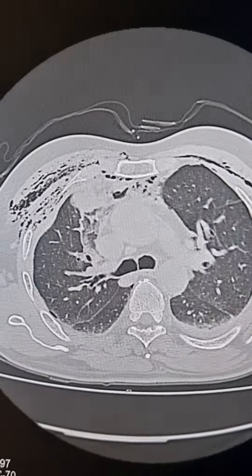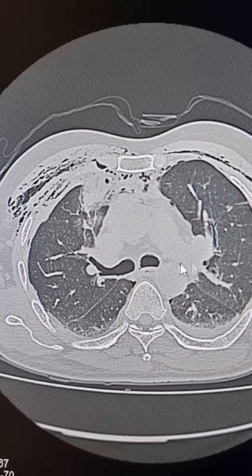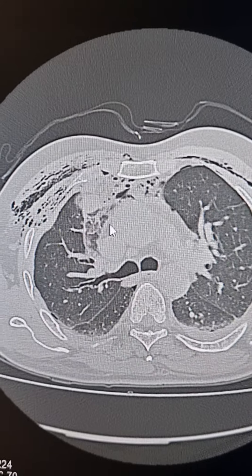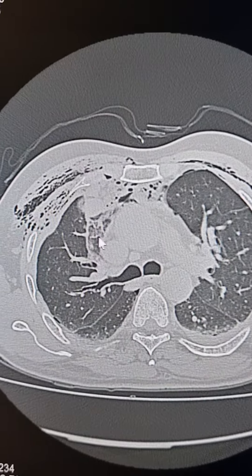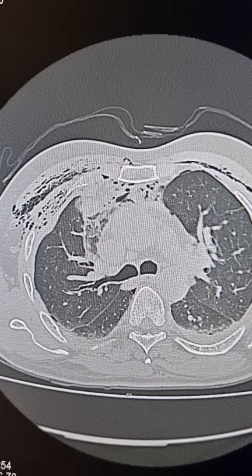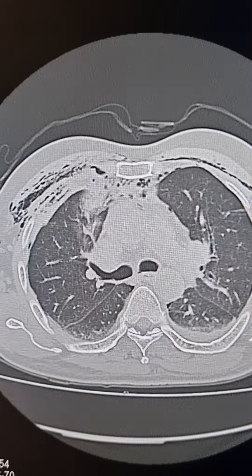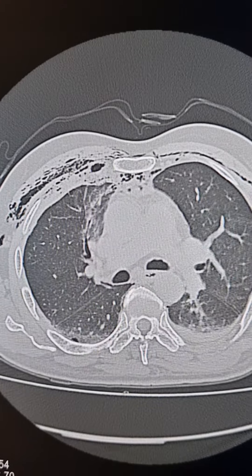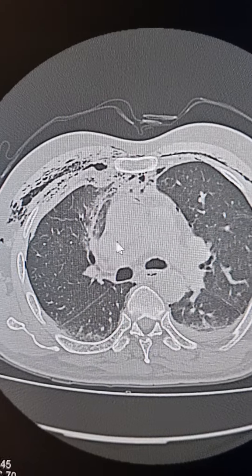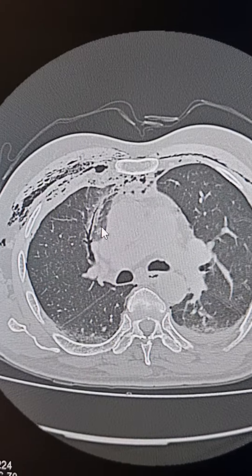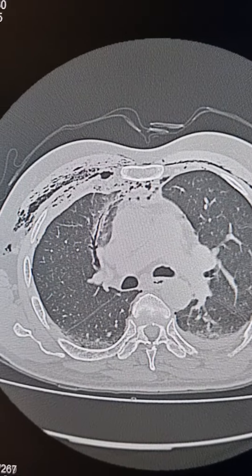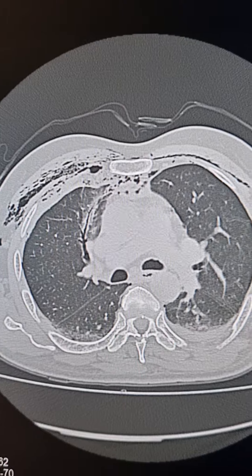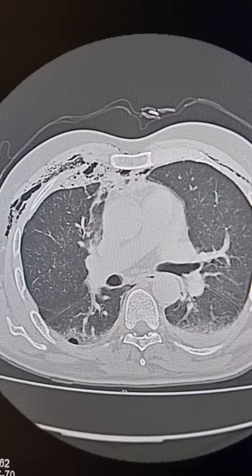Now please note this area of increased attenuation here in the anterior segment of the right upper lobe. These are lung contusions.